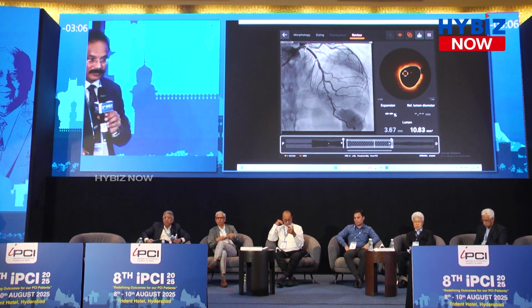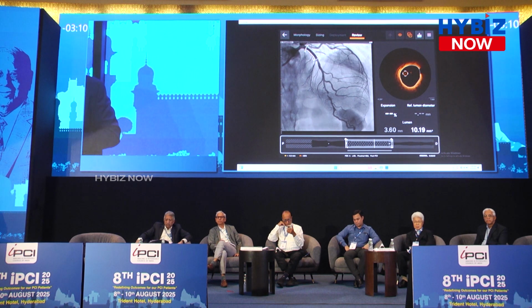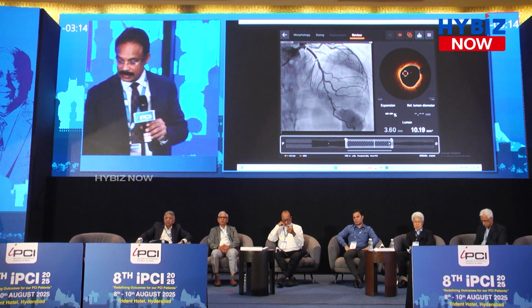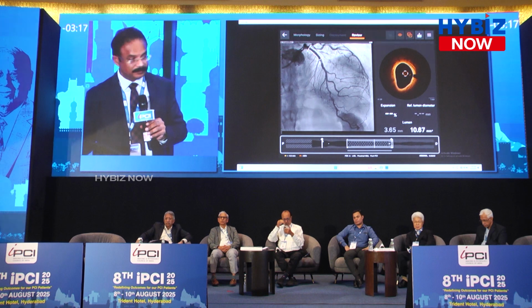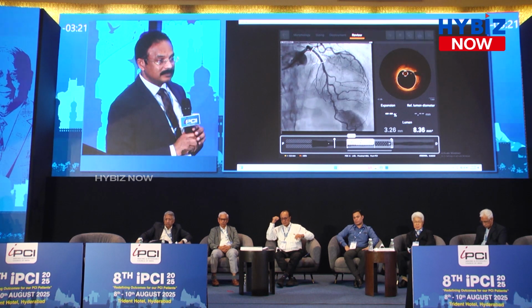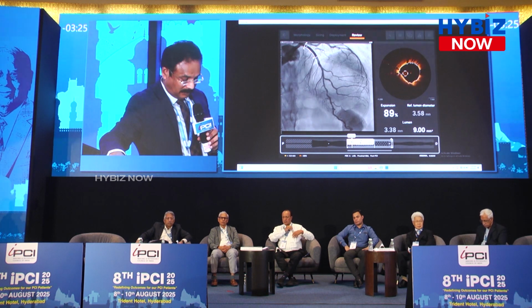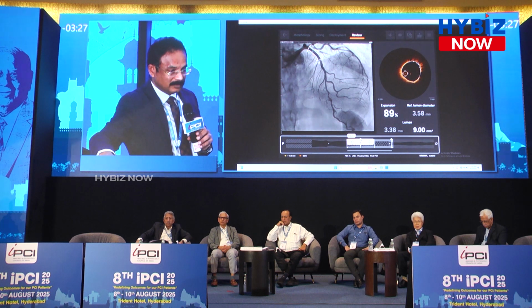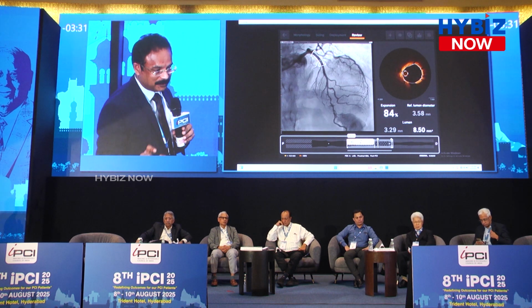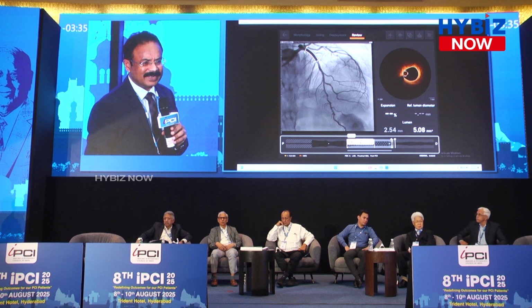Thank you. My experience when I chased it in the early days was that I would have a lot more tissue coming into it and the MSA would never increase. Your stent may look expanded, but the lumen area is much smaller. I think taking not very aggressive high pressure balloons, but a longer, steady expansion for a longer duration, and coming back, may be a better thing. Yes, Girish, I fully agree with you. This is the final result. There is no under expansion now. It's a proximal LAD big vessel, so an optimal result, I think, is essential.